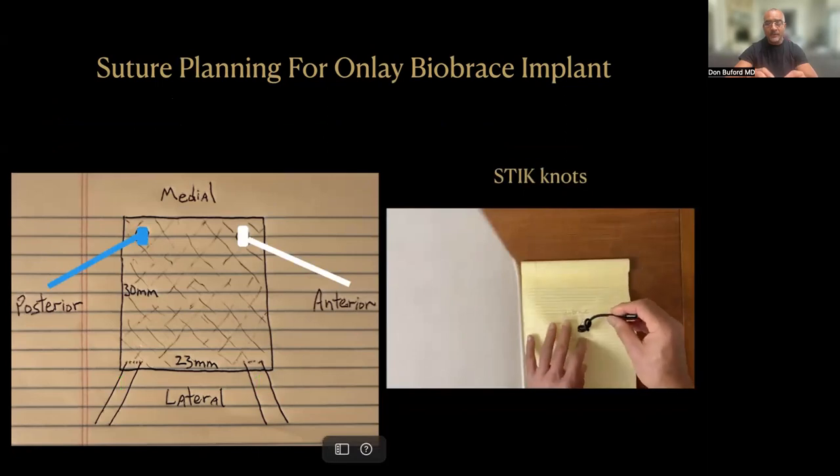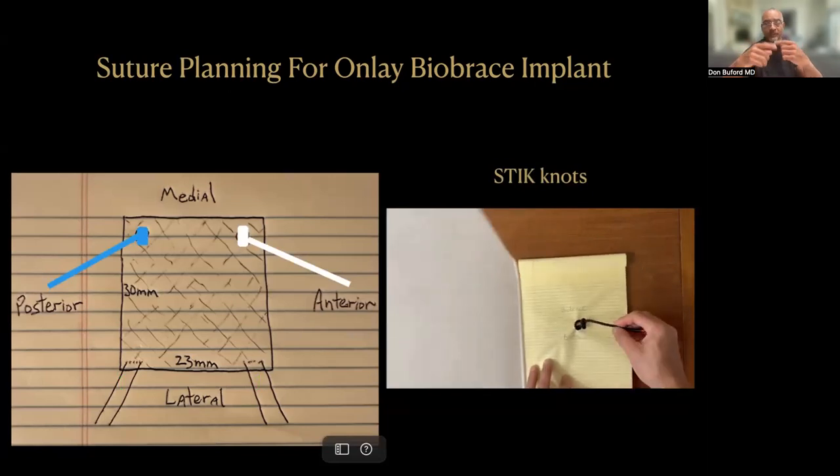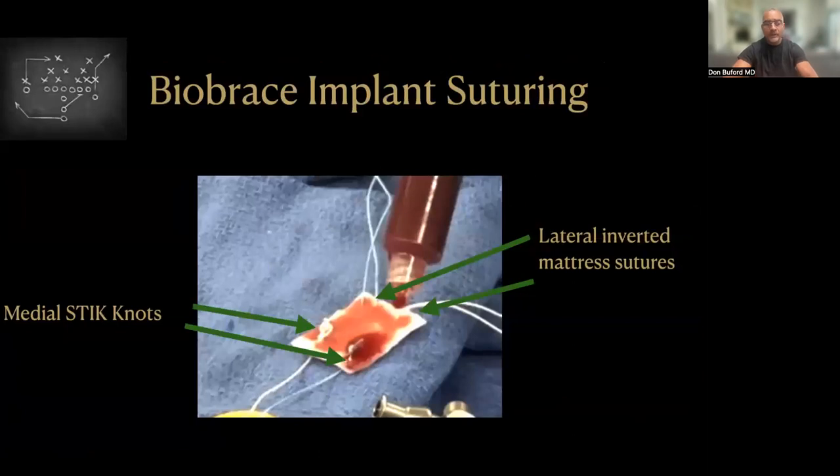These stick knots are illustrated in the video on the right — you're just taking the suture through the BioBrace and then passing four or five quick throws in a row to create a large knot that sits on top of the BioBrace. When you pull that knot, it pulls the BioBrace into position. We always use a surgical towel to keep the graft off the skin. Here you can see the medial stick knots in different colors to make planning easy, and here are our lateral inverted mattress sutures. We also pre-soak the BioBrace with a little bit of bone marrow concentrate.